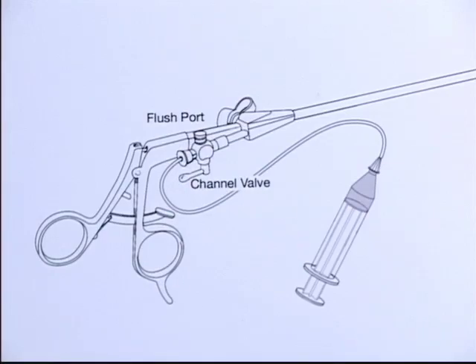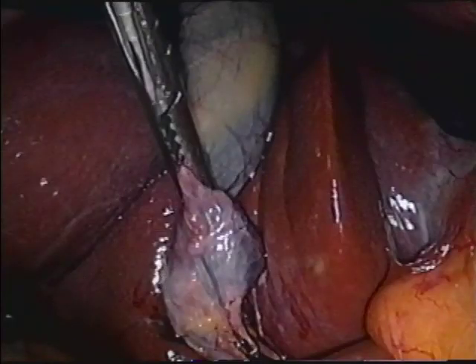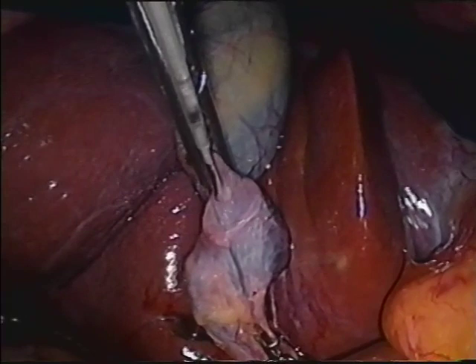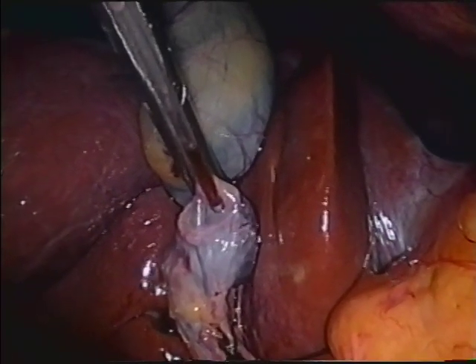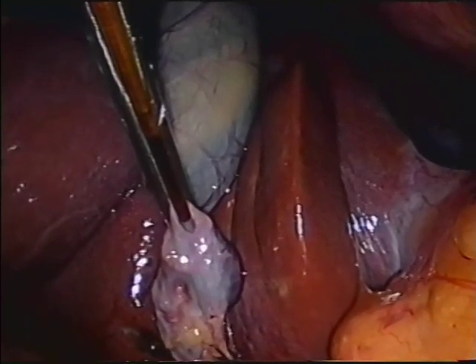The valve at the upper end of the clamp channel is now opened and the Kumar cholangiography catheter is introduced. The catheter is flushed to eliminate air bubbles. The clamp can be tilted or rotated to center the needle of the catheter into Hartman's pouch, and the catheter is advanced to puncture the Hartman's pouch.